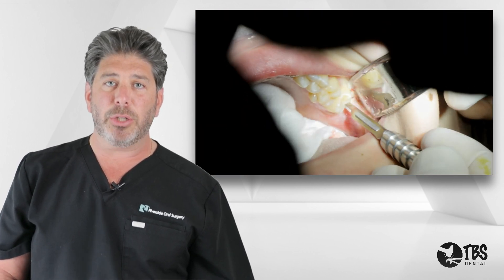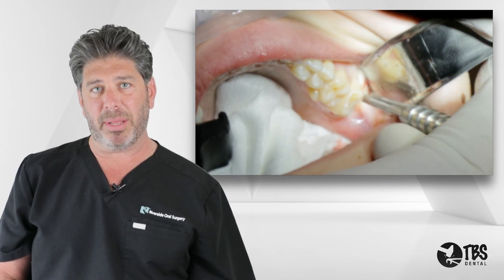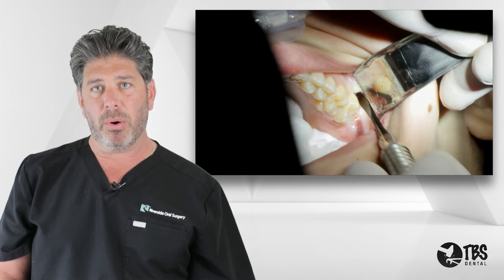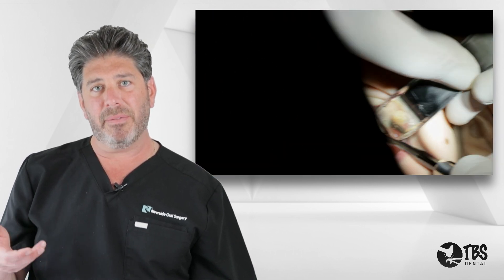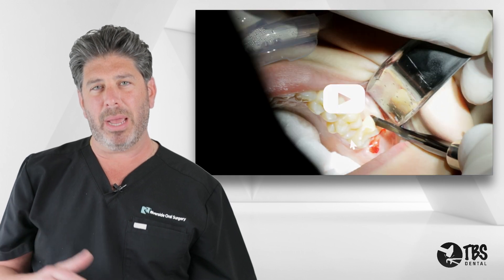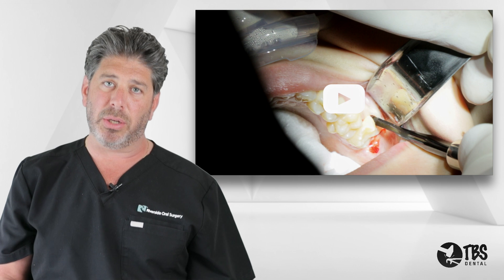Traditionally, I'll make my incision with a new 15 blade on the lower, intrasulcular, with a distal buccal release allowing for a full thickness flap elevation. Then I go to the upper where I start on the distal buccal around the tuberosity, bring it toward the palate, and elevate all the way up to about halfway through the second molar.